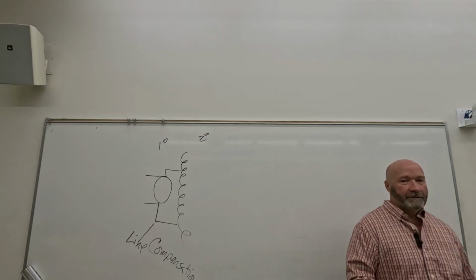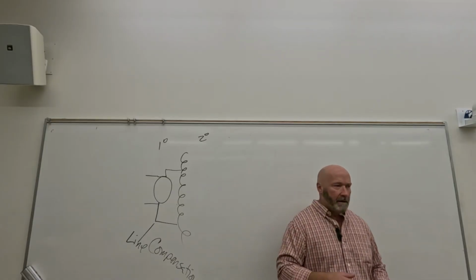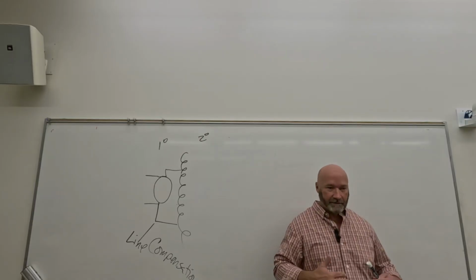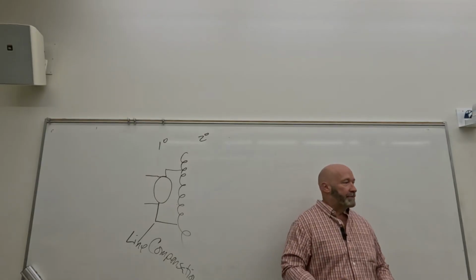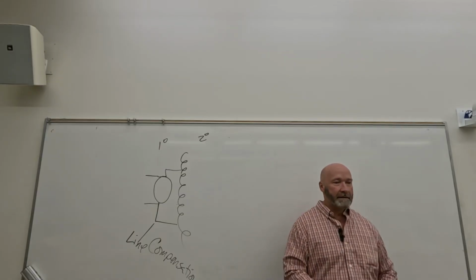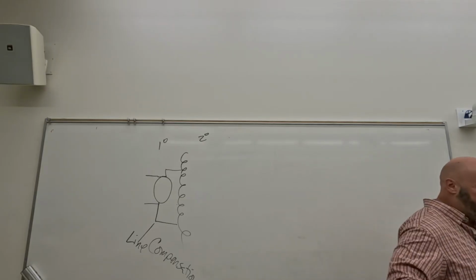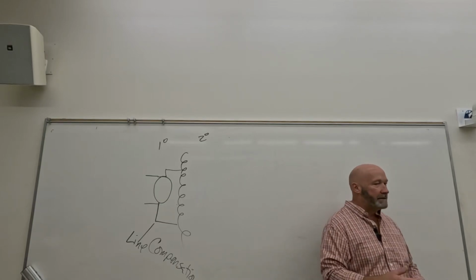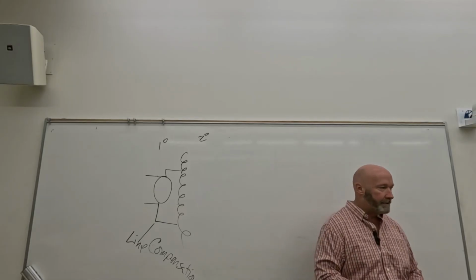And it's got a lot of stuff, all right? We're going to talk about that stuff later in the semester. It has evolved over time. Originally it just held the image receptor, but then a grid came into play. The purpose of a grid is to absorb scatter radiation, and then automatic exposure became a thing, so that's included as well. The image receptor is really the only thing that you see, but the Bucky has more to it, and some of those things you're going to manipulate from the control panel.